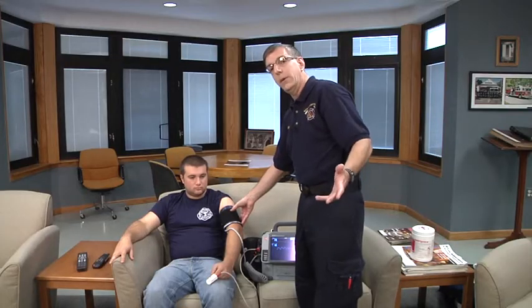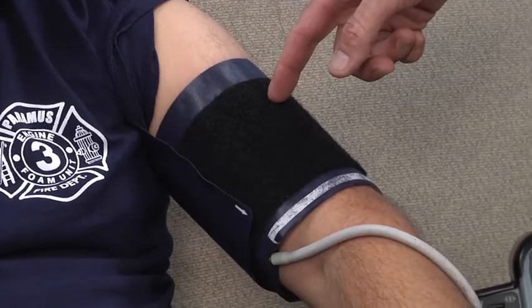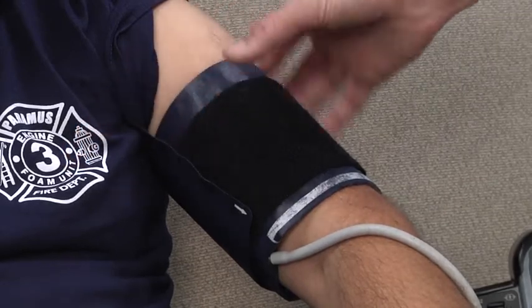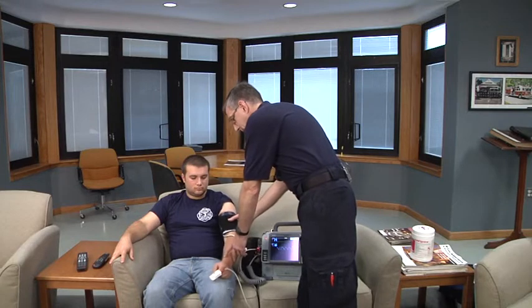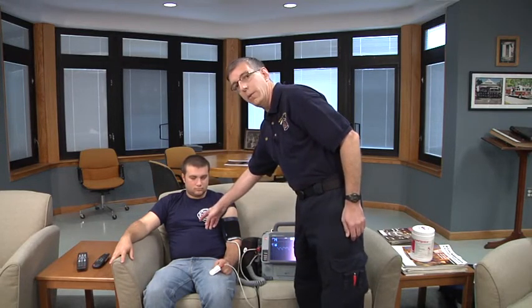Now the next piece of measuring blood pressure, regardless of the device that you're using, is the location of the extremity in relationship to the heart. You want the cuff to be at mid-heart level. So in this case, we'll ask the patient to relax his arm down to the side. The cuff is now at mid-heart level.